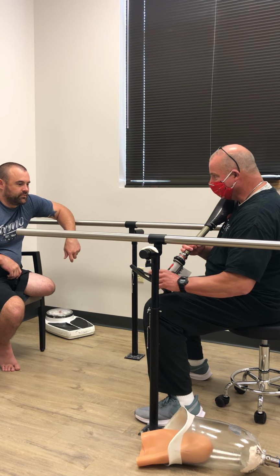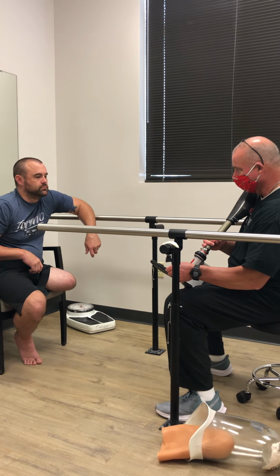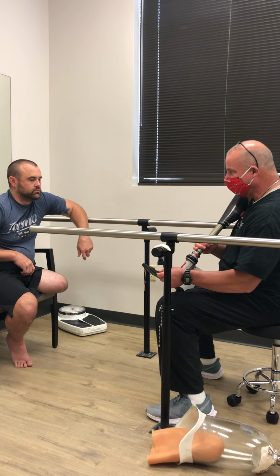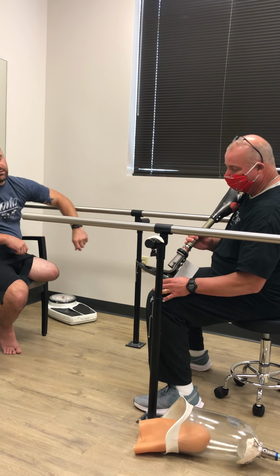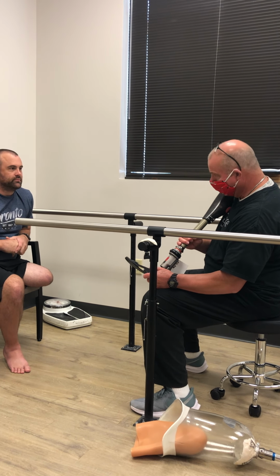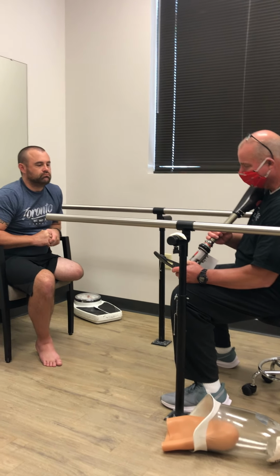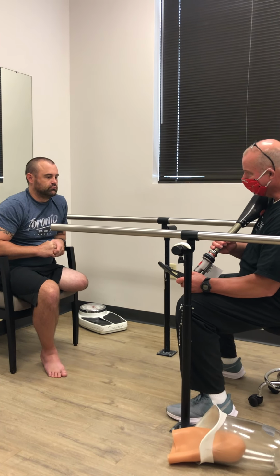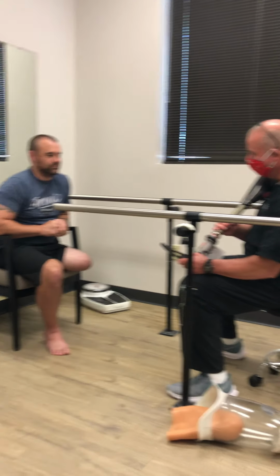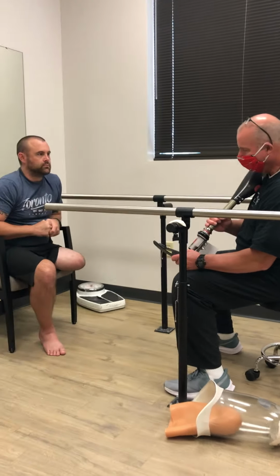And these hard edges of this carbon, and carbon is extremely hard. That sand will just eat it away. Yeah, I'm going, okay, it's almost time for a new foot. That is not covered under warranty, sand and all, because it's kind of like putting sugar in your gas tank. They would expect you to do that. So there's some maintenance to it, but as long as you're careful, even that won't be a problem.